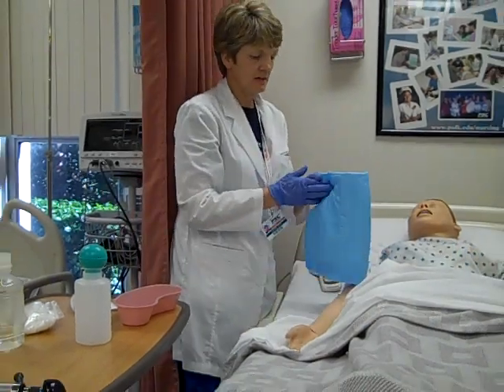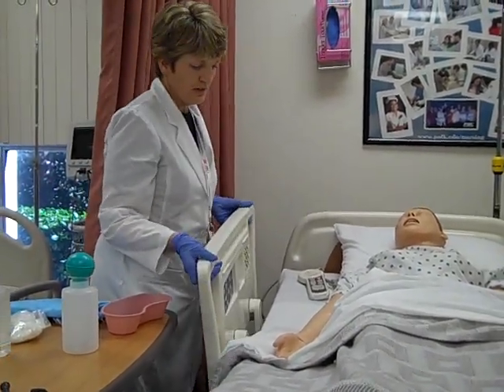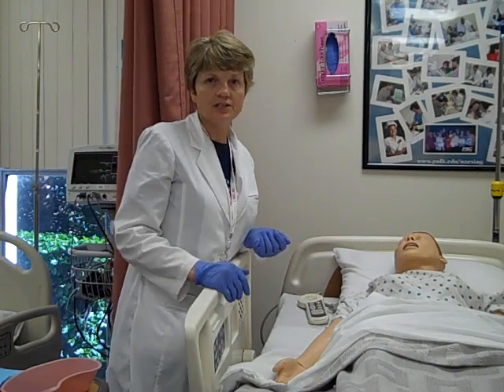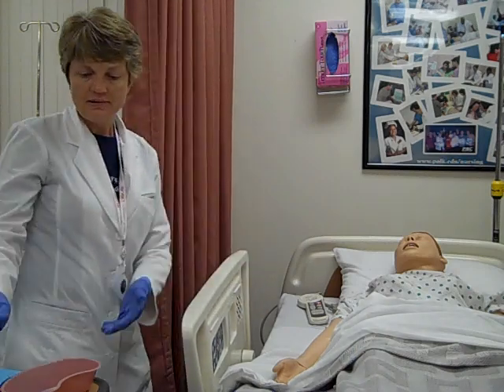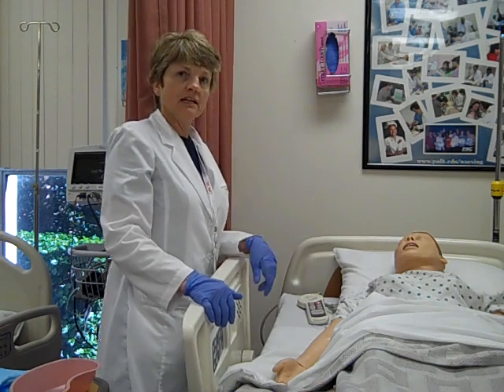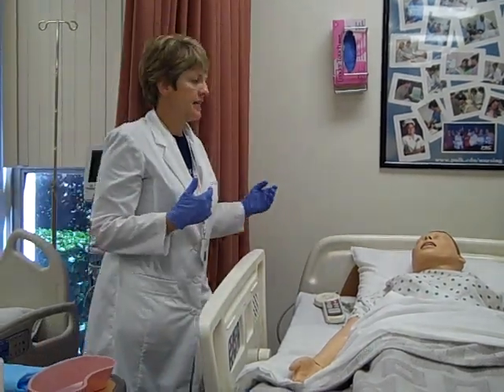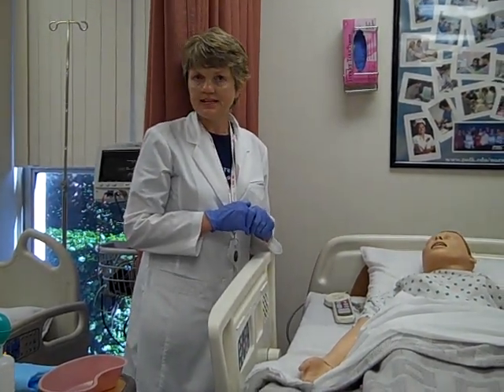I'll clean up the patient, put them in a comfortable position, and put the side rail up. At this point you want to think about documenting: the assessment of the eye before you irrigated, how much irrigation solution you used and with what, how the patient tolerated it, what your return was and what it looked like, and then a post-assessment of the eye — how it looked after, whether it's red, whether it's any less irritated.